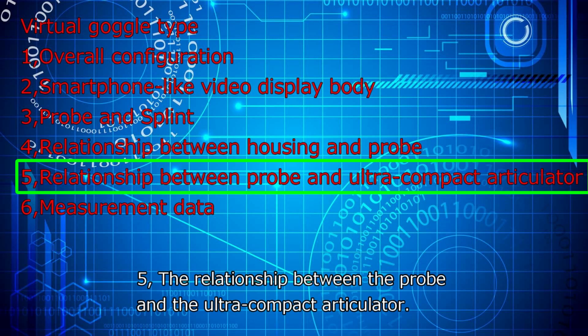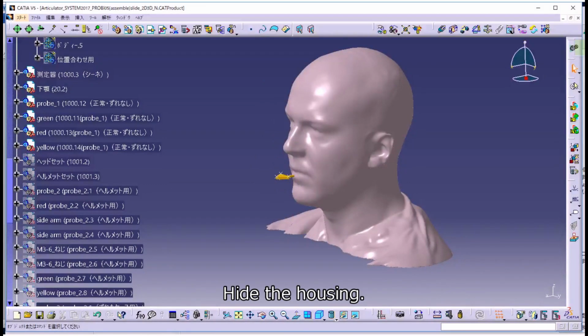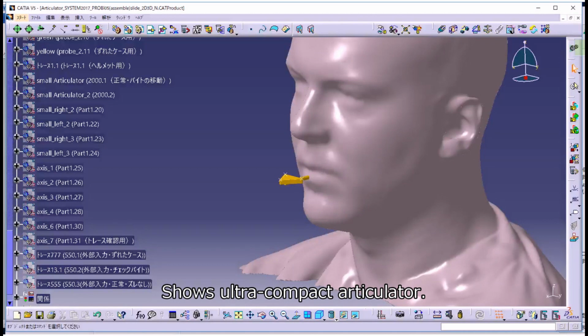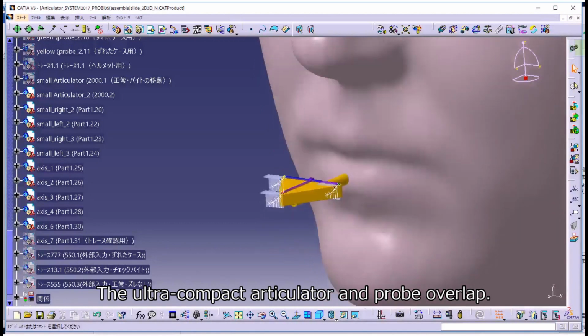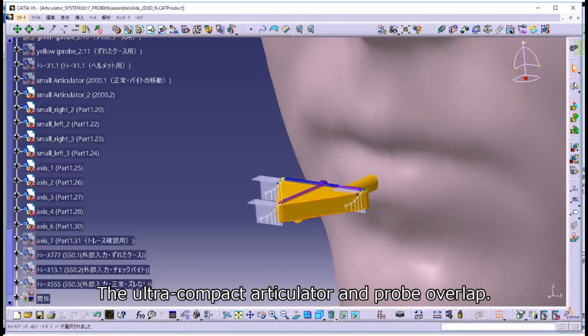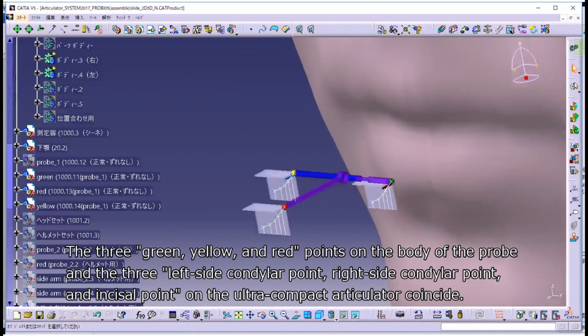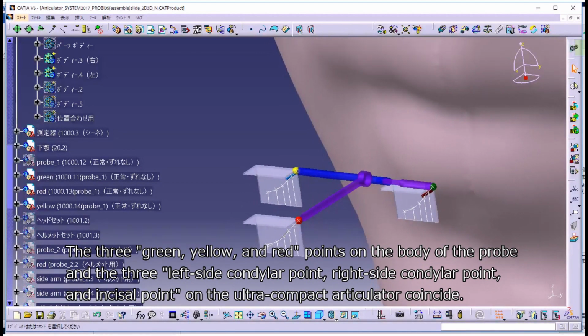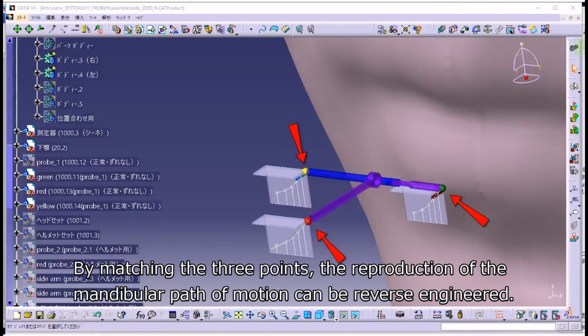5. The relationship between the probe and the ultra-compact articulator. Hide the housing. Shows ultra-compact articulator. Enlarge the ultra-compact articulator. The ultra-compact articulator and probe overlap. Hide the body of the probe. The 3 green, yellow, and red points on the body of the probe and the 3 points, left side condylar point, right side condylar point, and incisal point, on the ultra-compact articulator coincide. By matching the 3 points, the reproduction of the mandibular path of motion can be reverse engineered.